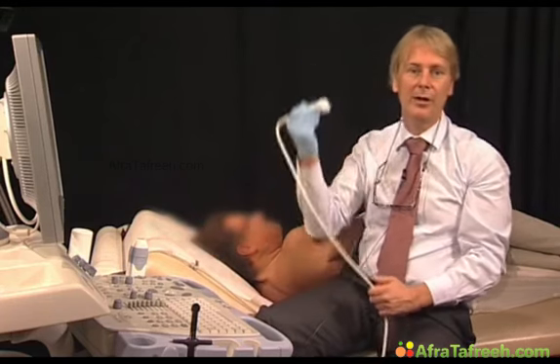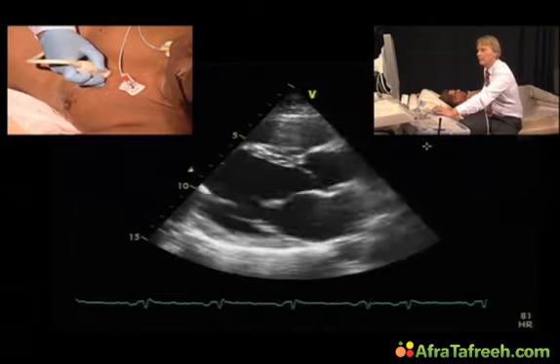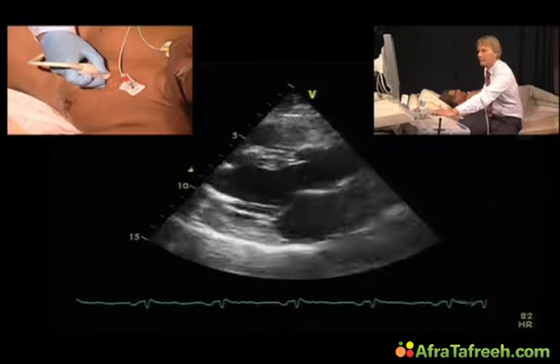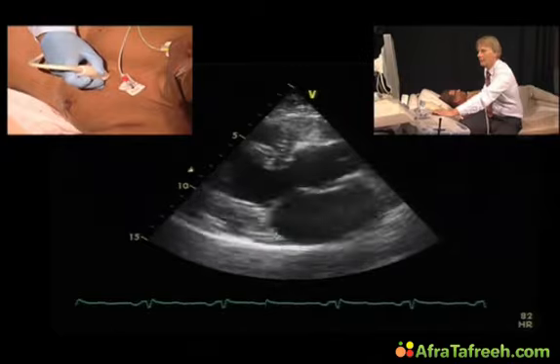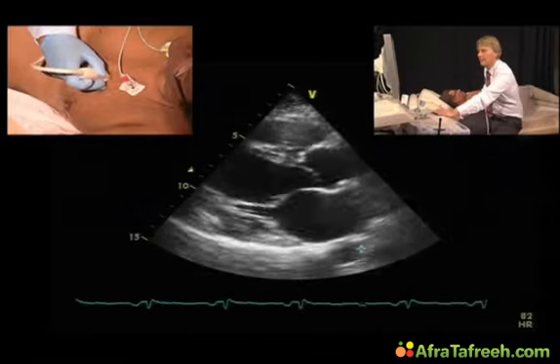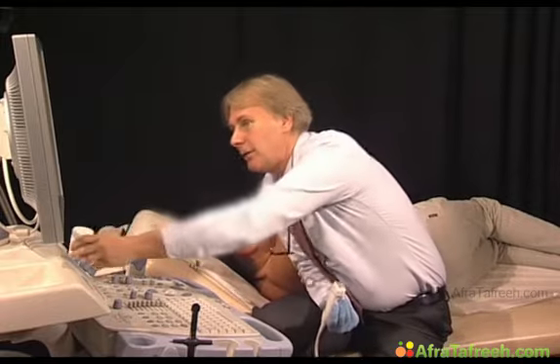This is a patient with endomyocardial fibrosis, and I will now show you the typical features that we can find in such patients. In the parasternal long axis view, we can appreciate that there is fibrosis of the subvalvular apparatus, which extends here into the papillary muscle and also into the posterior mitral valve leaflet. You can see that the posterior leaflet is restricted in its motion, and we can expect at least some degree of mitral regurgitation in this patient. But the real typical findings for endomyocardial fibrosis are usually seen in the apical views.